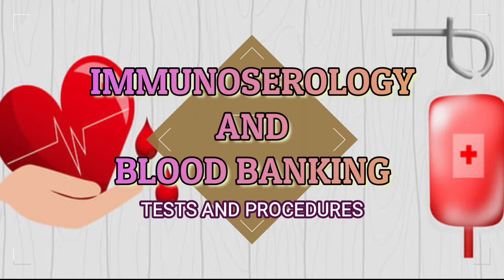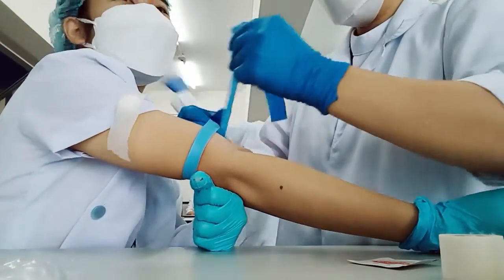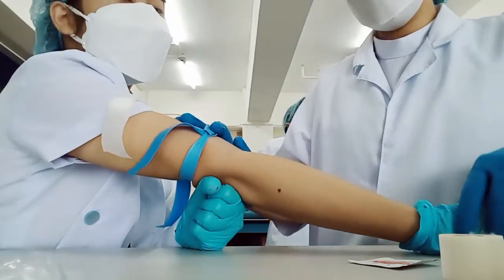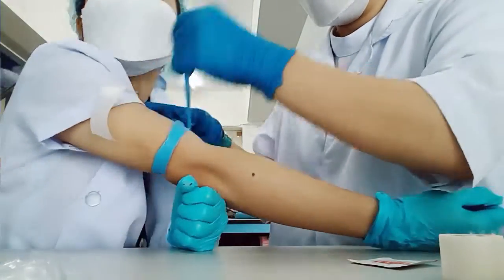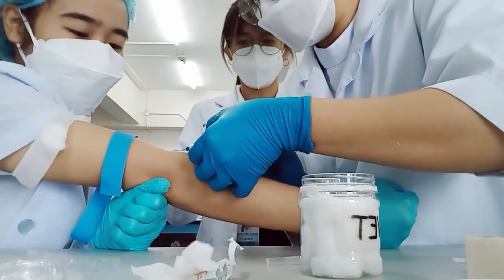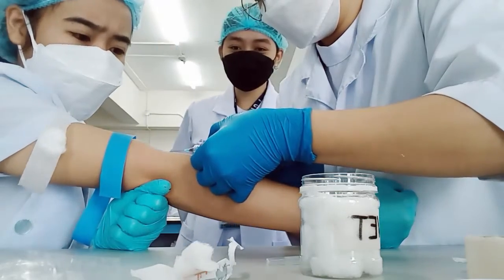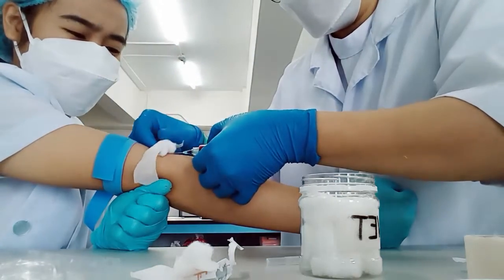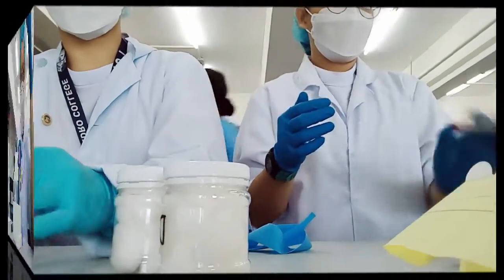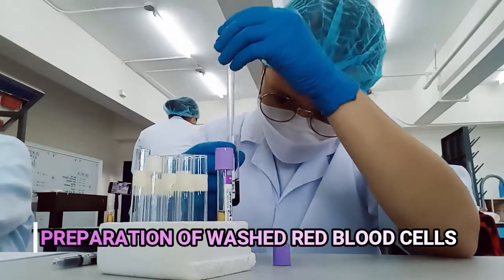Immunoserology and blood banking tests and procedures. Start with the blood extraction. Preparation of washed red blood cells.